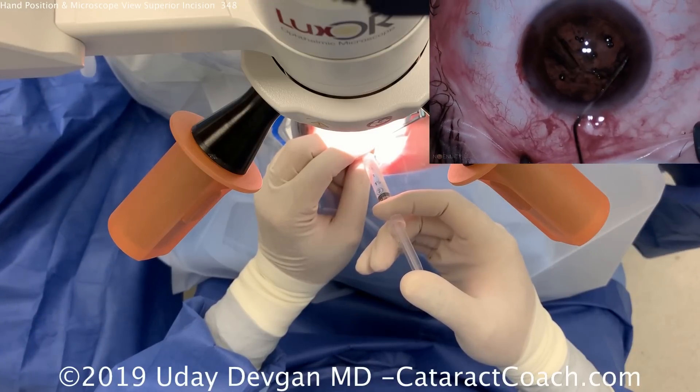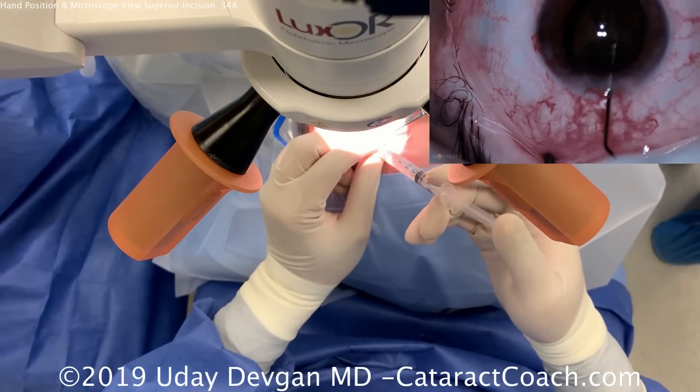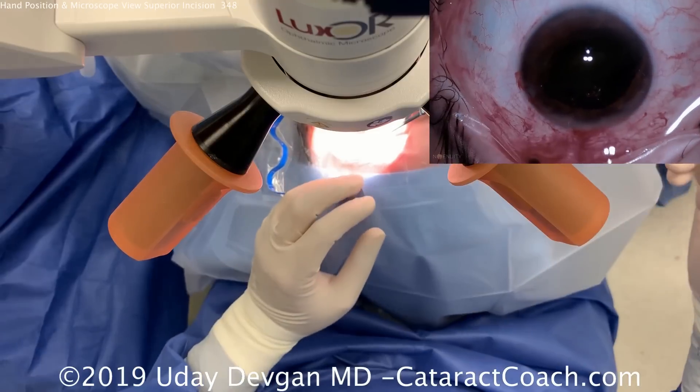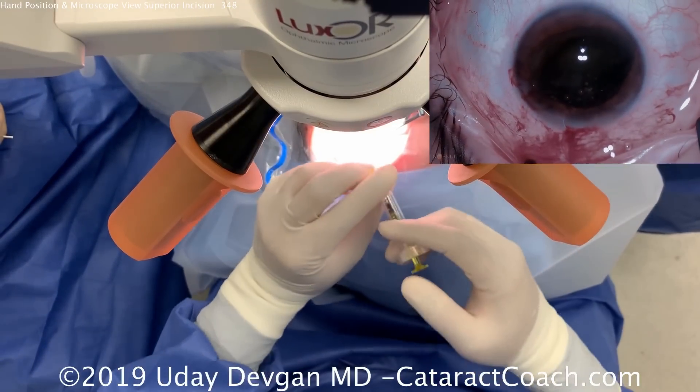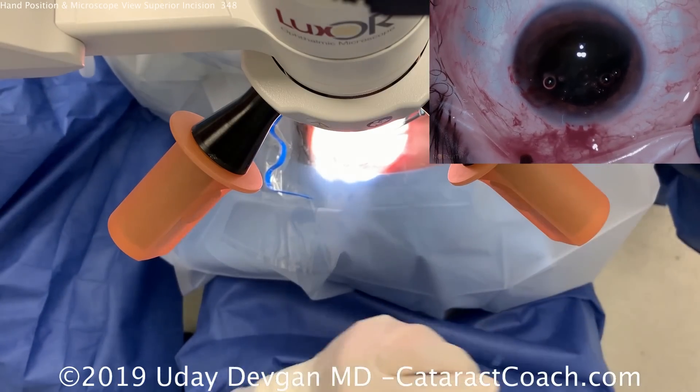In this case, it's not too dense of a nucleus, so here we'll prolapse it out of the bag. Particularly in cases involving Flomax or IFIS — floppy iris — it's helpful to get the nucleus partway out of the capsule bag. Now a more dispersive viscoelastic is used to protect that central corneal endothelium.